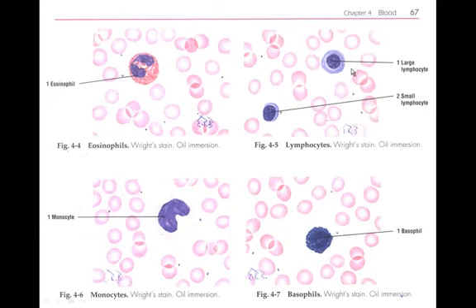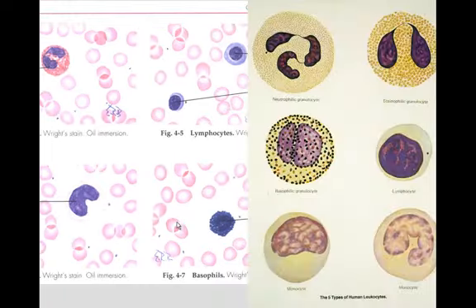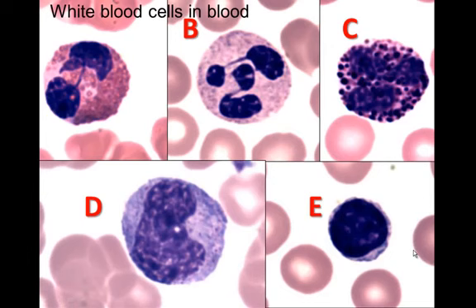A couple more lymphocytes, and here we see a monocyte. A monocyte is a cell in the blood that eventually makes a macrophage. So we can see those here: eosinophil, basophil, monocyte, lymphocyte, and then again we can see a hieroglyph of his drawing. A neutrophil that has granules inside, a lobulated nucleus, eosinophil with big granules, basophil with big blue granules, and some granules are above the nucleus, as you see, which impedes your view of the nucleus. Lymphocyte and monocytes, as we see there.